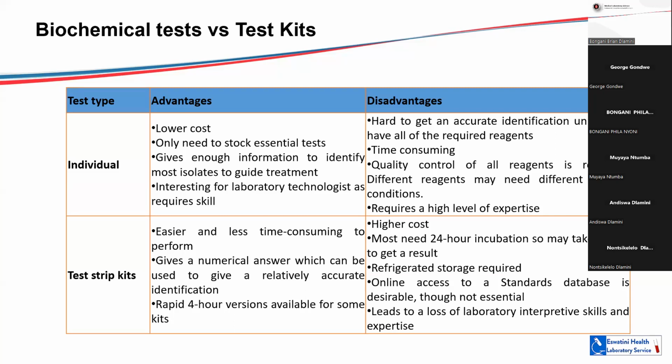Advantages and disadvantages of the test strips, now, the API: the advantage is that it is easier and less time consuming to perform, as I explained earlier, and it gives a numerical answer which can be used to give a relatively accurate identification.